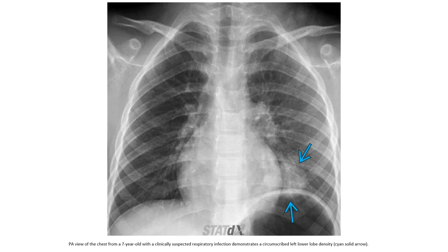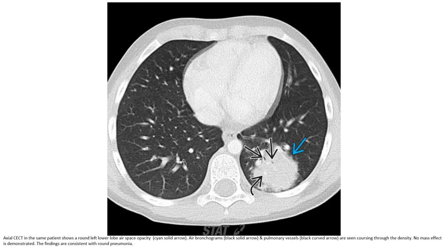This is a PA view of the chest from a seven-year-old with clinically suspected respiratory infection, demonstrating a circumscribed left lower lobe density. Axial non-contrast CT in the same patient shows a round left lower lobe airspace opacity. Air bronchograms and pulmonary vessels are seen coursing through the density. No mass effect is demonstrated. The findings are consistent with round pneumonia.